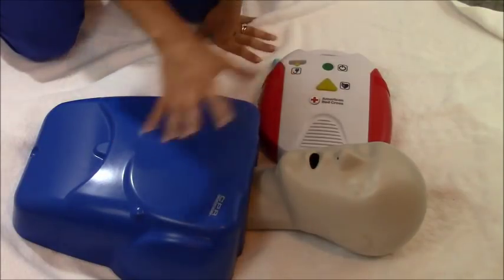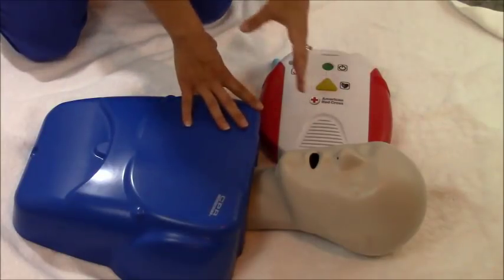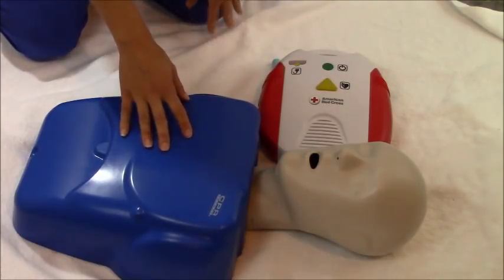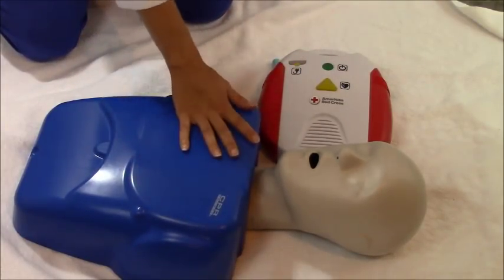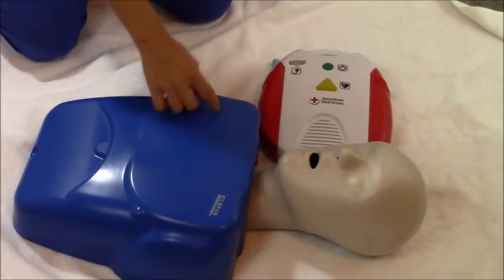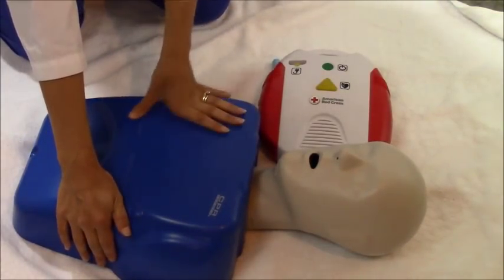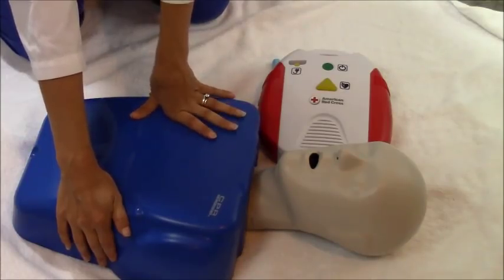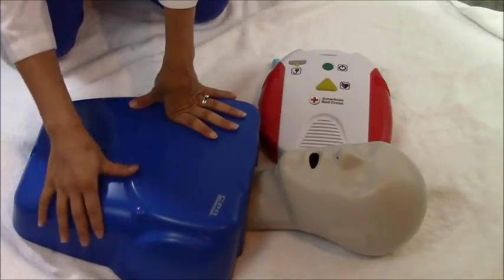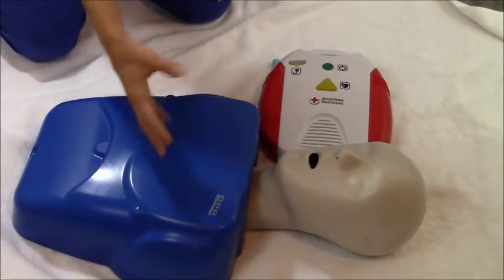If you're by yourself, you would stop CPR and use the AED. When the AED arrives, the first thing to do is look at the patient's chest. If they have a hairy chest and there's a razor in the kit, quickly trim the hairs where the pads will go — the right upper chest below the collarbone, and below the left nipple a few inches below the armpit. Some AEDs include extra pads; you can use one to rip the hair off if no razor is available.